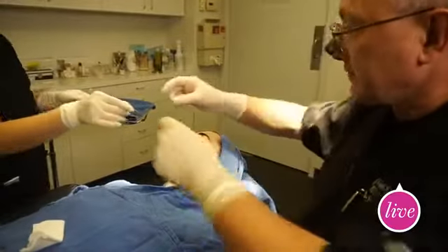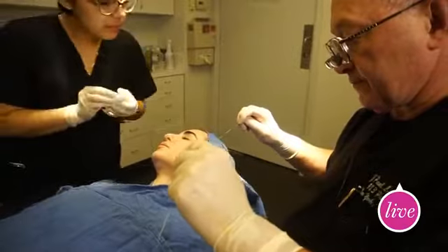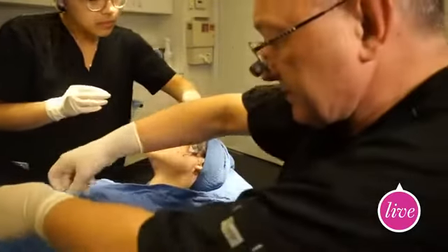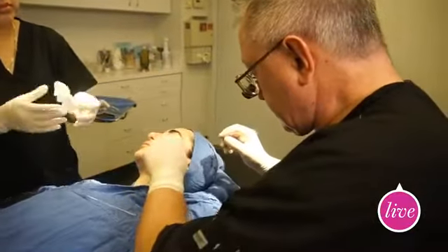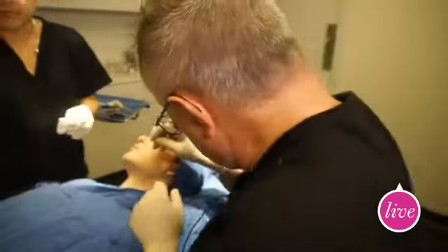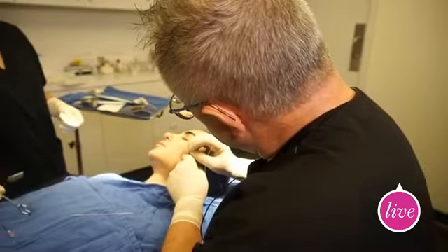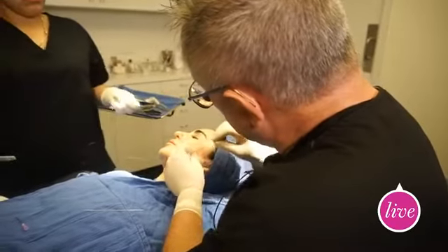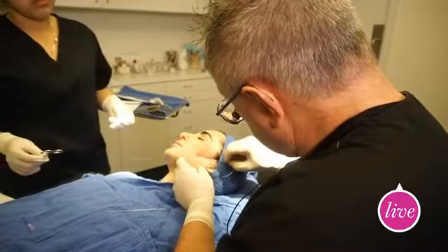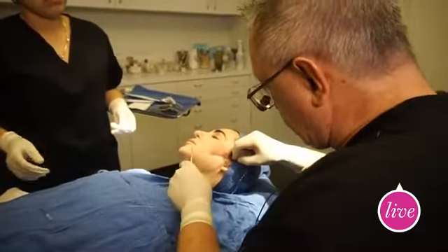Tatiana also wants to know how long it takes for the sutures to dissolve in total. Probably about 16 months, 16 to 18 months. And can you just recap again how it leaves behind better collagen production? So it makes type 1 collagen. As we get older, we lose that. So type 1 collagen is the young collagen, the more pliable collagen. It's a better collagen.